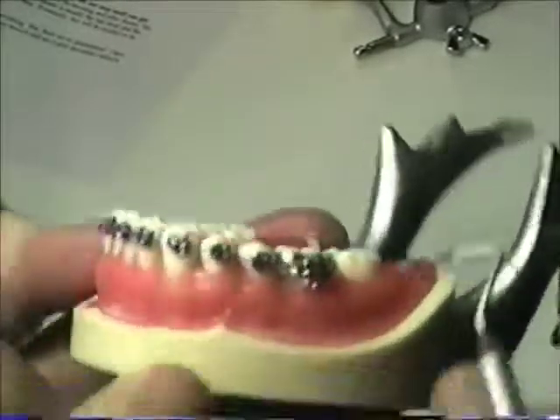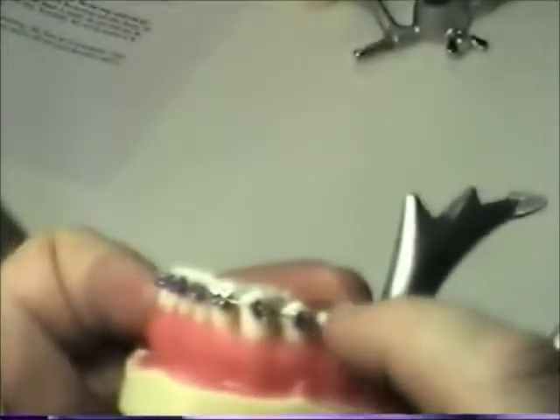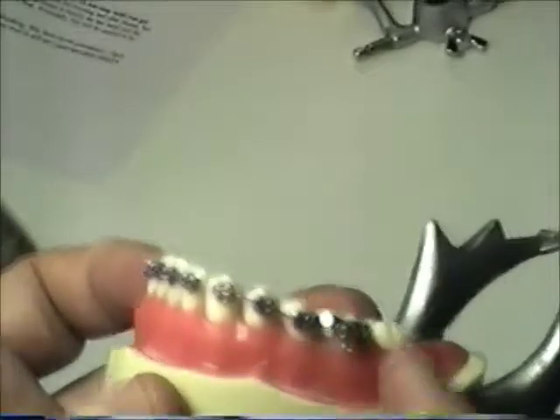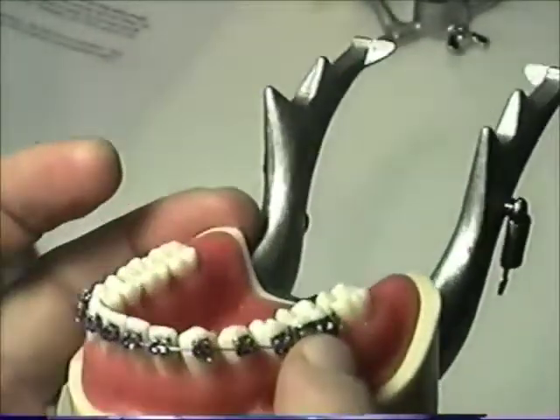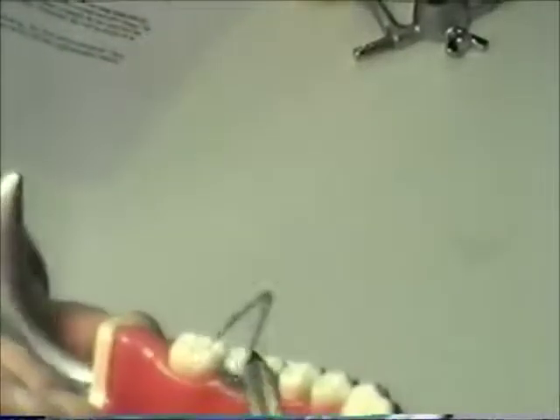But again, if you're out here with the Waterpik and you're just spraying the tip of my finger, and you're giving your teeth a shower, you're wasting your time. Then you're not even water picking. Now, also you've got the back side.